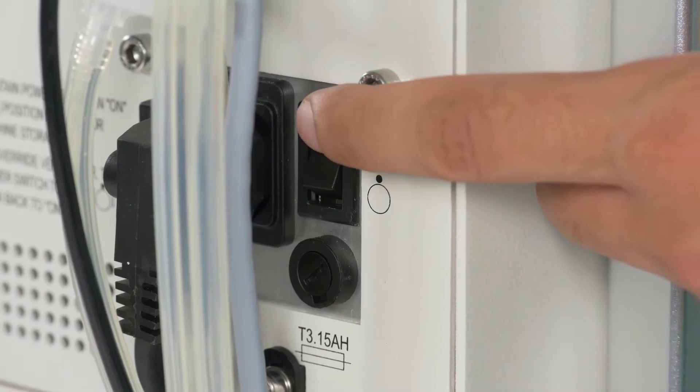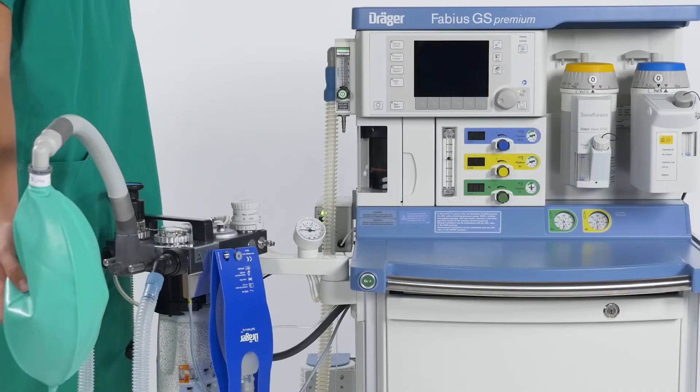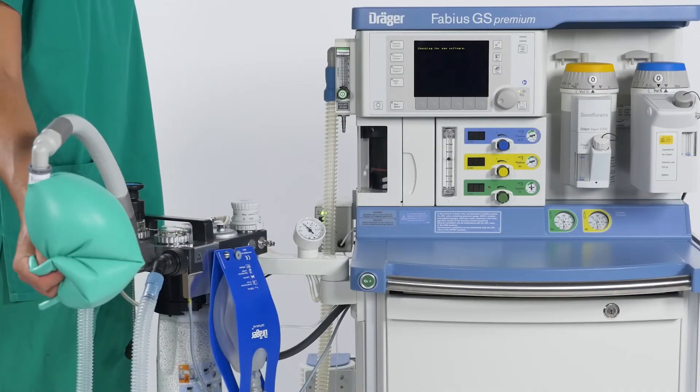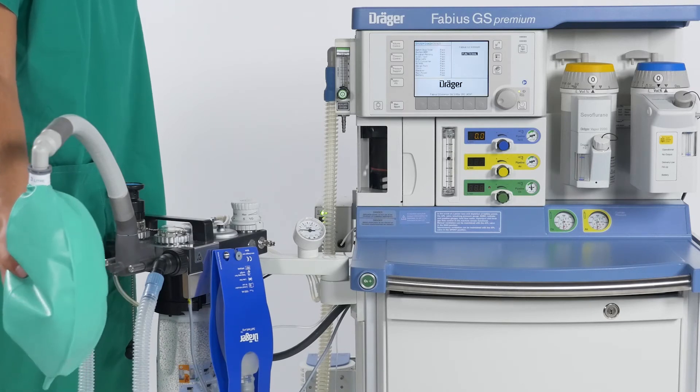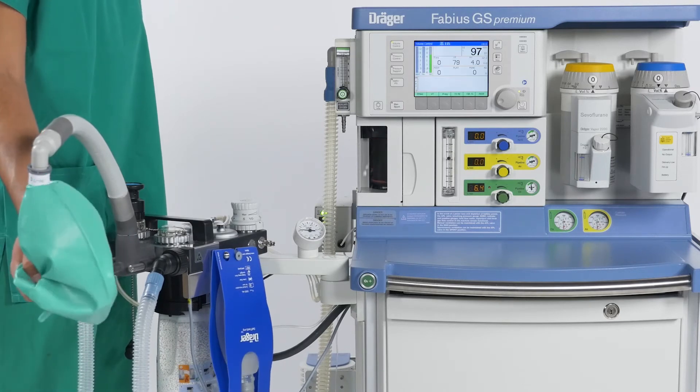You can now switch on the Fabius GS Premium. It will perform a brief system test and will go to Manspont mode. All the time, you can continue to manually ventilate.